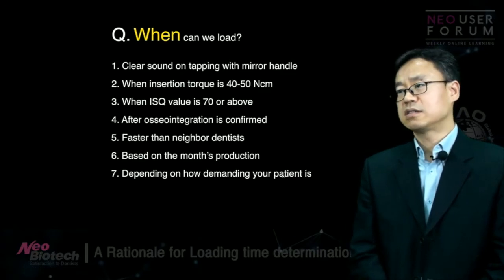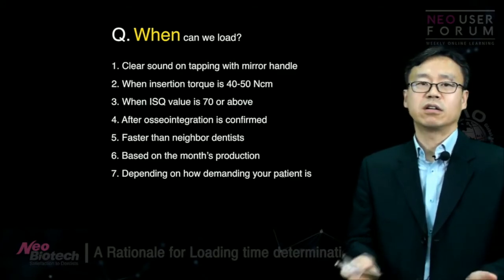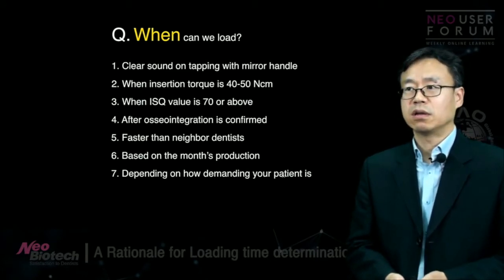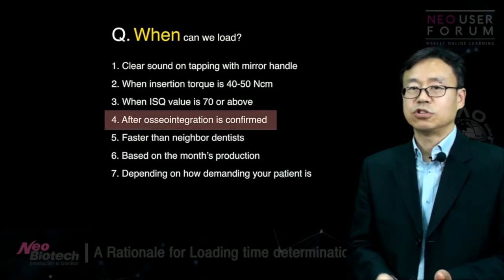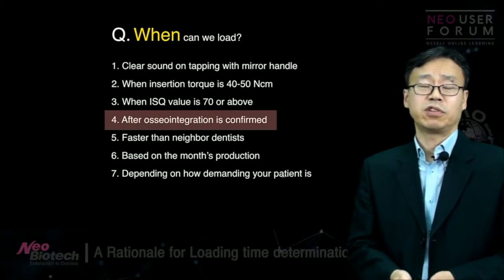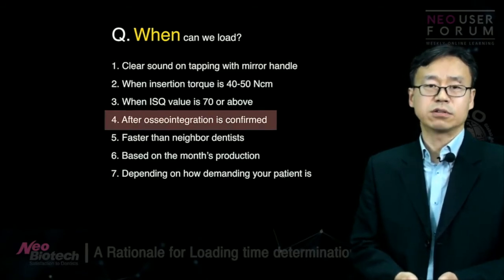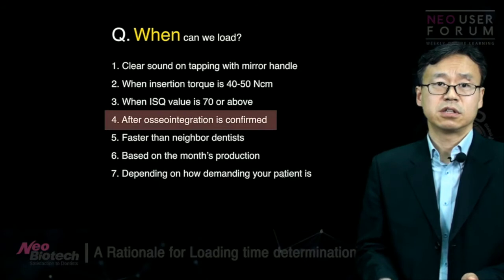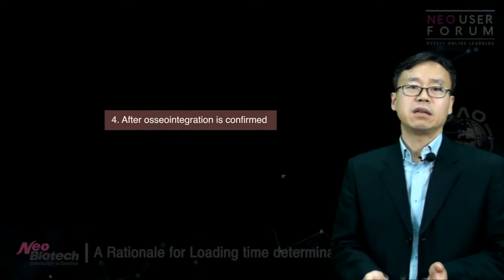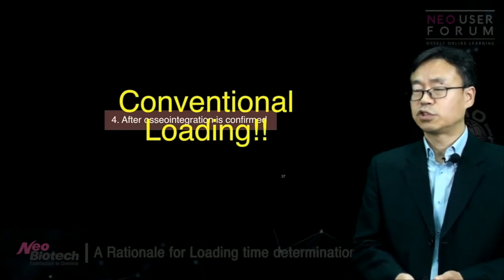I think all of these can be right, depending on the situation, depending on what you believe. But I'm sure no one would argue with number four: you should have osseointegration. Because this is what we've been taught over the years in dental school, and also after you graduate from dental school. You must have osseointegration. And this is called conventional loading, a 2-month waiting period.